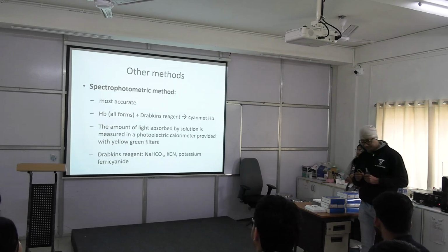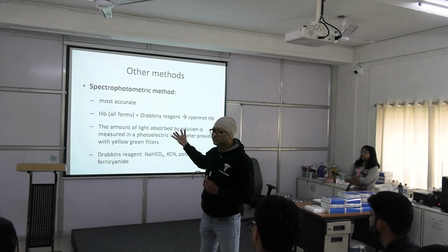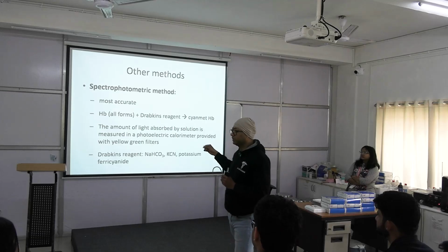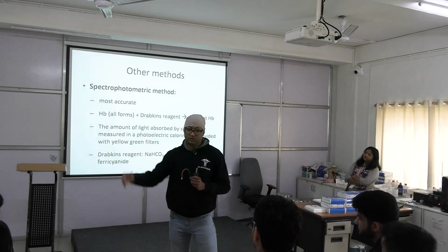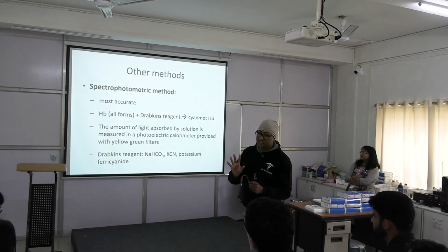Spectrophotometric method. So what do we do in this? This we are not going to learn because everything is machine, okay? So nothing to do here in the spectrophotometric method. Okay, this method we use in the central lab where patient service is there. And this is for learning purpose only. Not only learning purpose, we do it for mass screening.